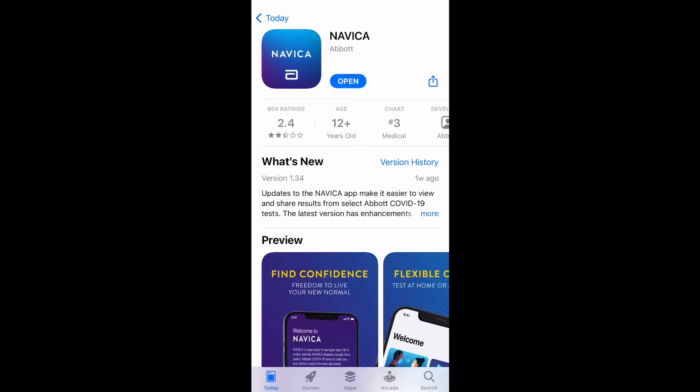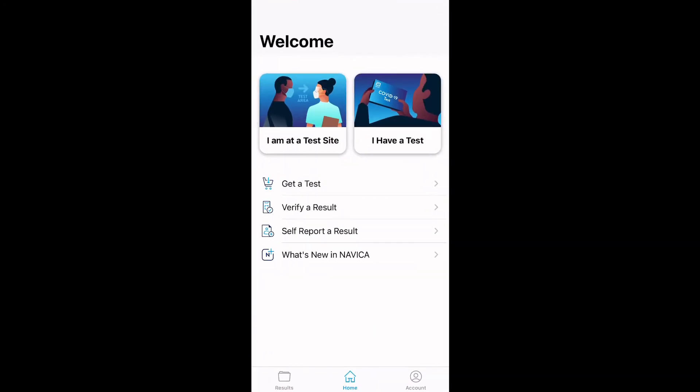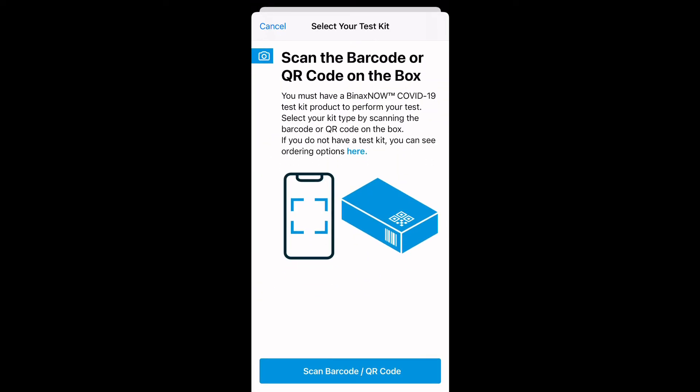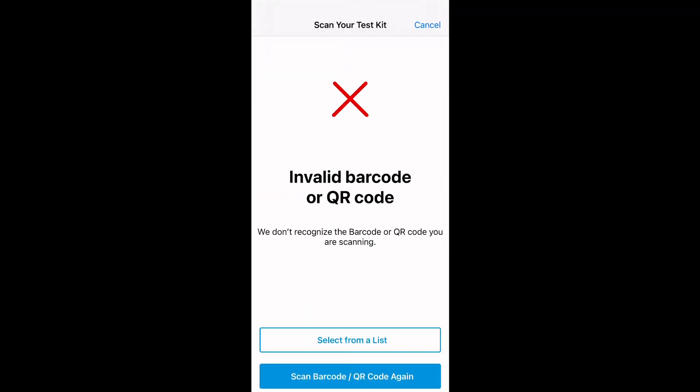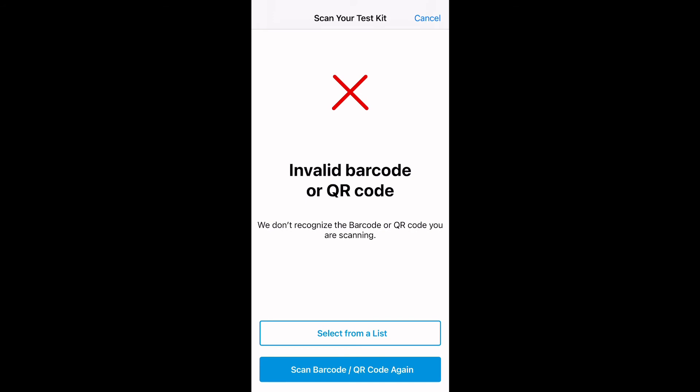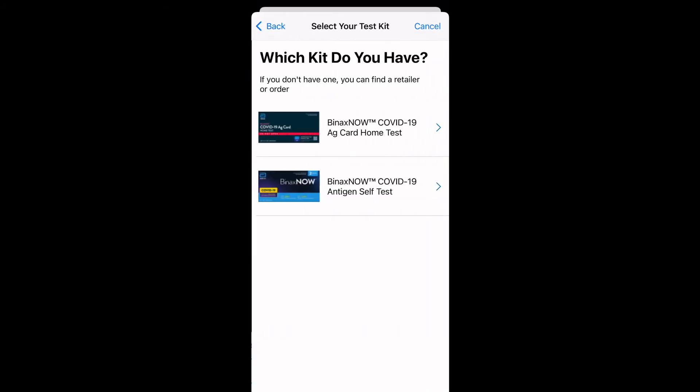At this point, you can have the patient record his or her results on the Navica Abbott app and just follow the prompts. He didn't have the box on this. You guys will have the box when you do it at home. Make sure you save that box and then scan the barcode on the side. And then it's going to ask you questions, and then you're going to scan the card itself. This is invalid because we don't have the box.